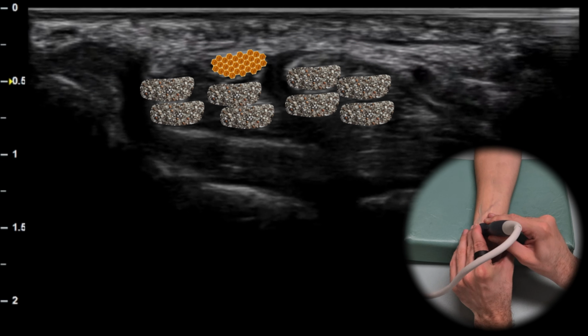To distinguish the median nerve from the tendons, you can observe their structure. The nerve resembles a honeycomb pattern, while the tendons have a characteristic salt and pepper appearance.